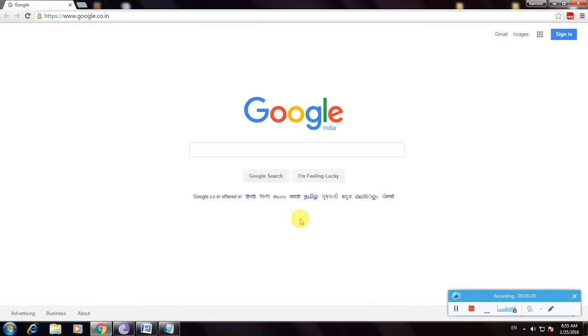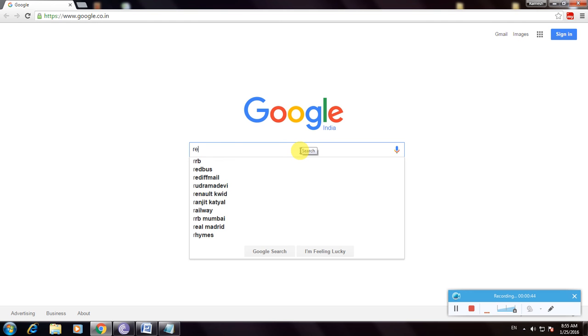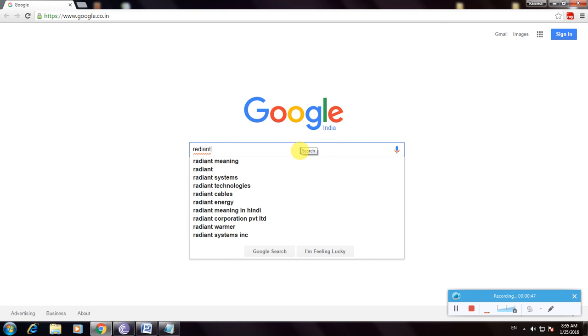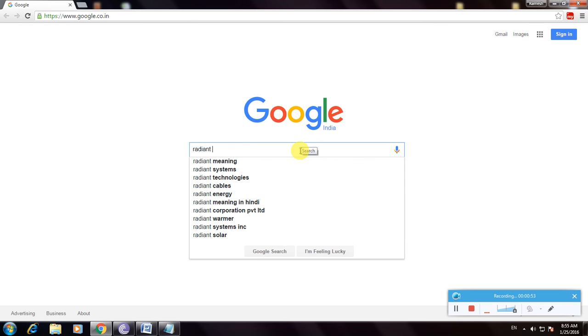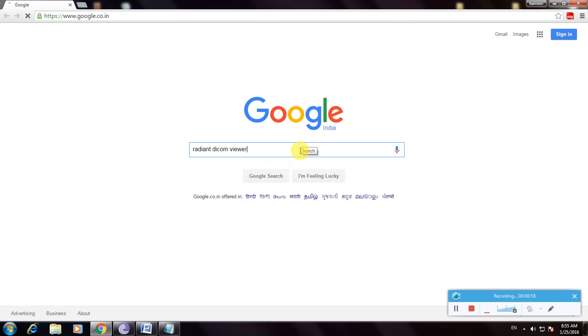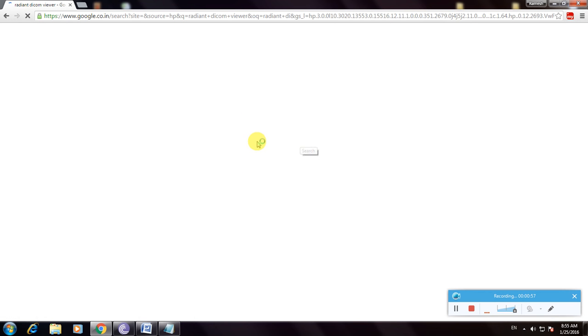This is the Google home page. Now search for 'RadiAnt DICOM viewer' and click enter.